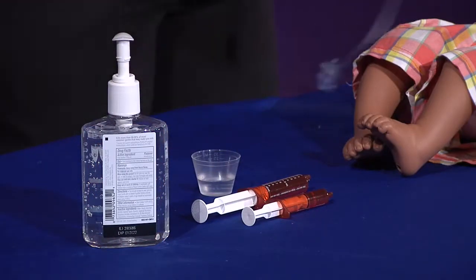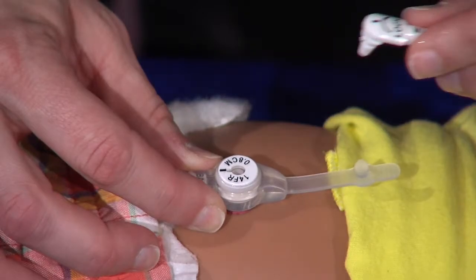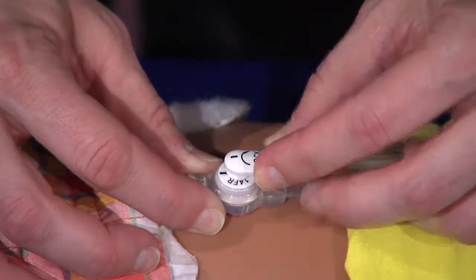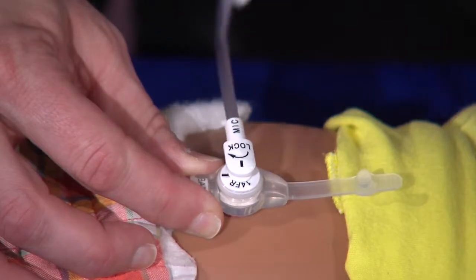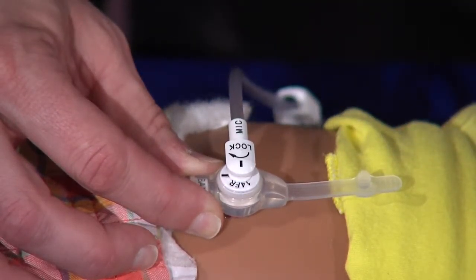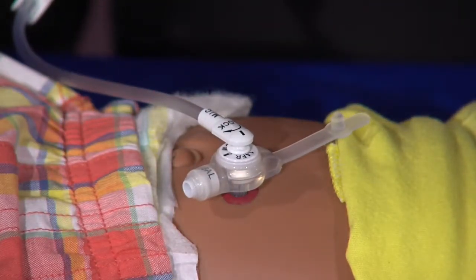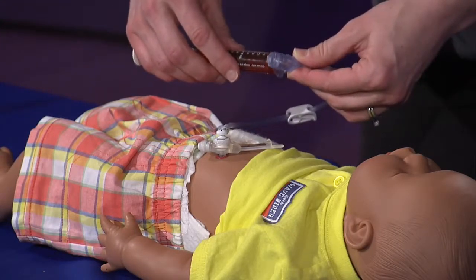Attach the extension tubing to the button. In order to attach the tubing, you will need to support the button with one hand while lining up the 2 small black lines with your other hand. Push down the extension tubing while supporting the actual button. Then turn the tubing in the direction of the arrow. Open the cap on the end of the extension tubing and attach the tip of the water-filled syringe.